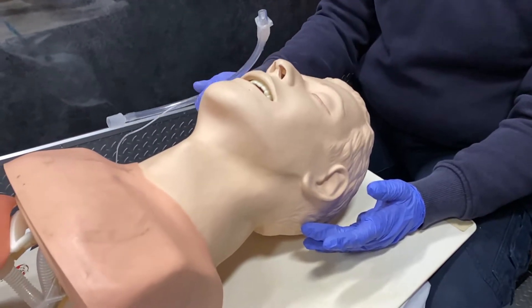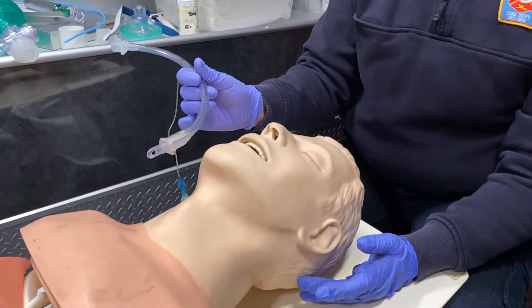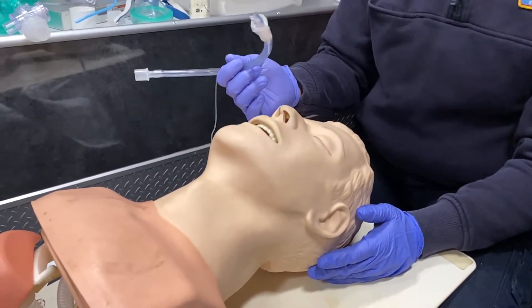They also have to be breathing. When we insert this tube and pass through the epiglottis, we actually need them to be inhaling so that the epiglottis is lifted out of the way, because this is a blind insertion. This is why it's very rarely used.